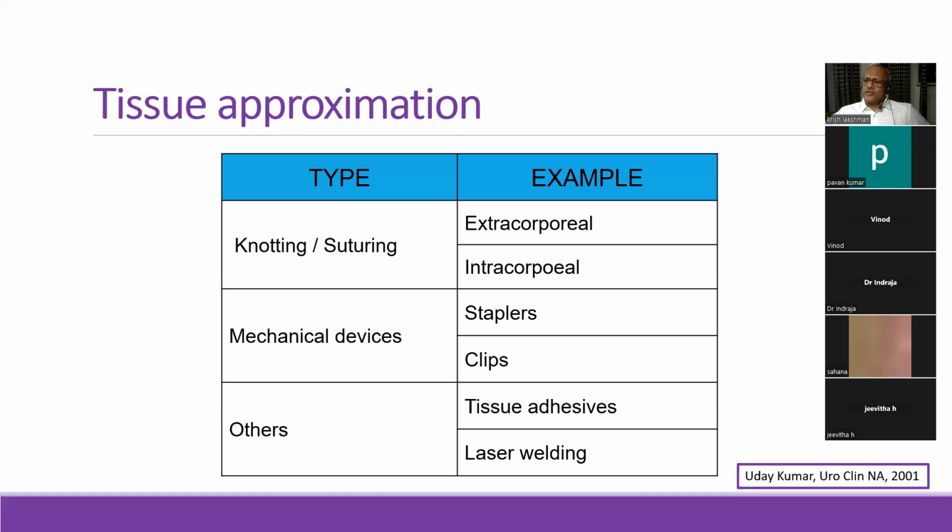It starts off as a slip knot, but the important thing is the knot is fashioned outside the abdomen. It forms a semi-slip knot is the word I would use for that. And it slips down, you can push it down into the abdomen, tie it where you want. And when you actually tighten it by pushing the knot down onto the structure, it becomes a firm knot. Not a slip knot anymore. That's the way the knot is designed. Intracorporeal, you form the knot inside.